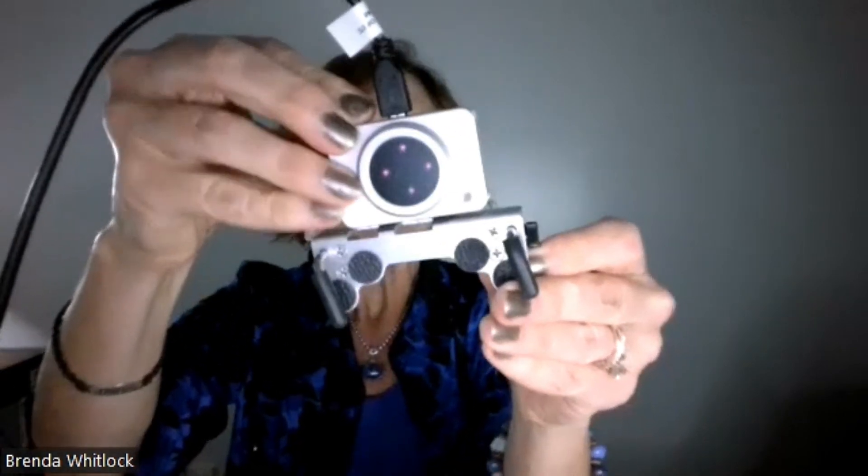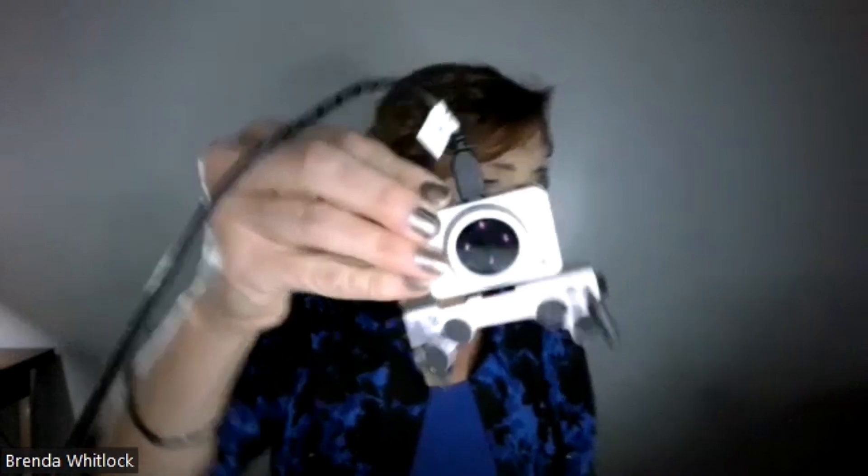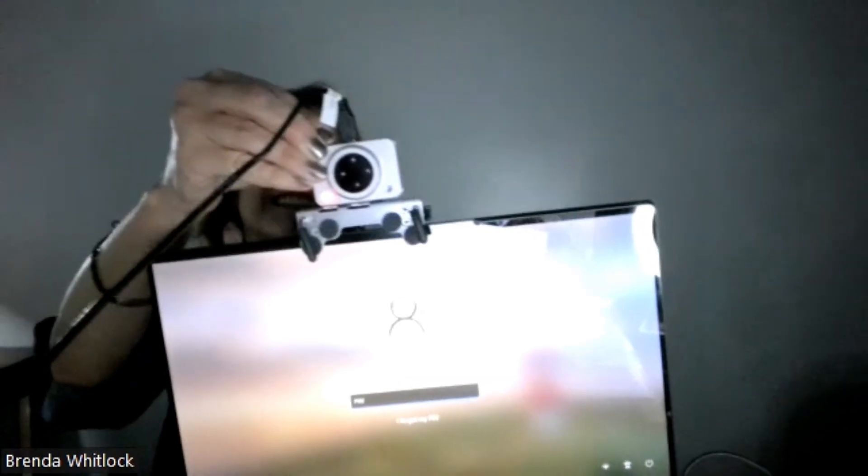It just snaps right in there. Then we're going to set the mount on the laptop. I'll show you how it goes on — you just set it right there, and it sits nice and easy right on top of your laptop screen. We're going to go ahead and set it up there.